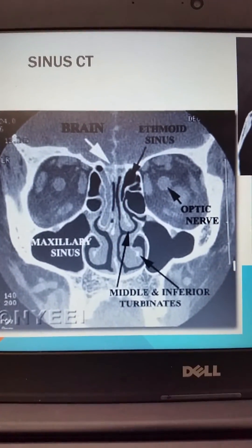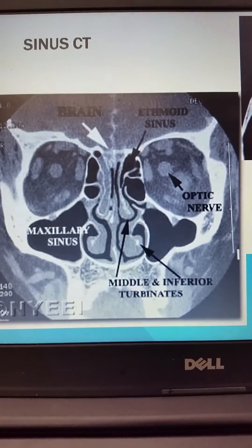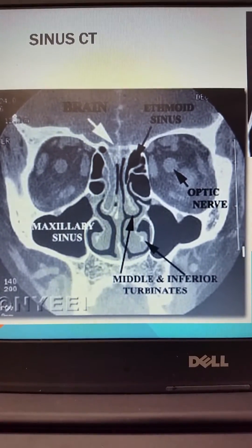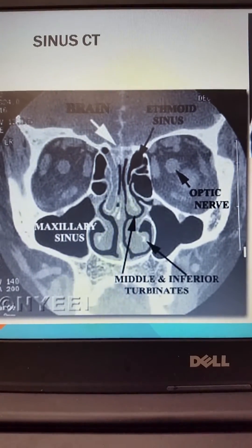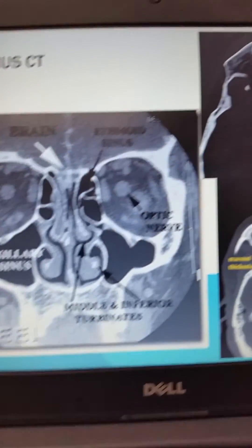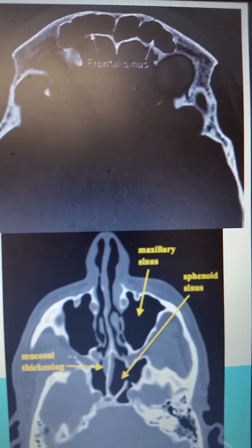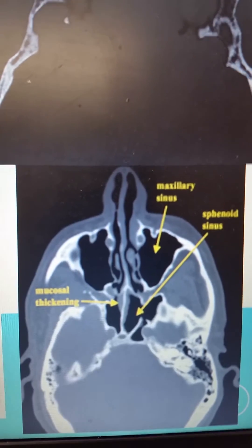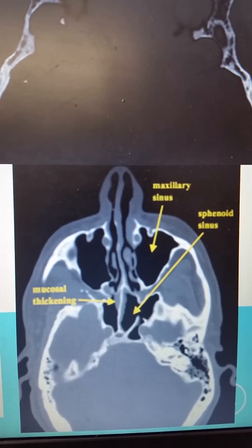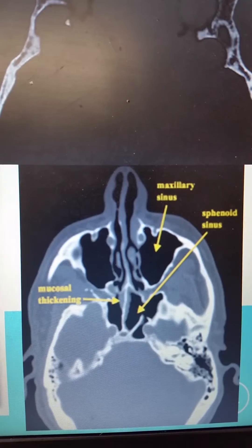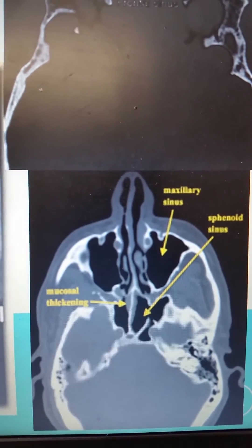Looking at a sinus CT, you can see the ethmoid sinus as well as the maxillary sinus, with the middle and inferior turbinates visualized quite nicely. Another CT image allows us to see the frontal sinuses, and further imaging in the coronal view shows the maxillary sinus and sphenoid sinus — where you'll notice mucosal thickening, indicative of either acute or possibly chronic sinusitis.